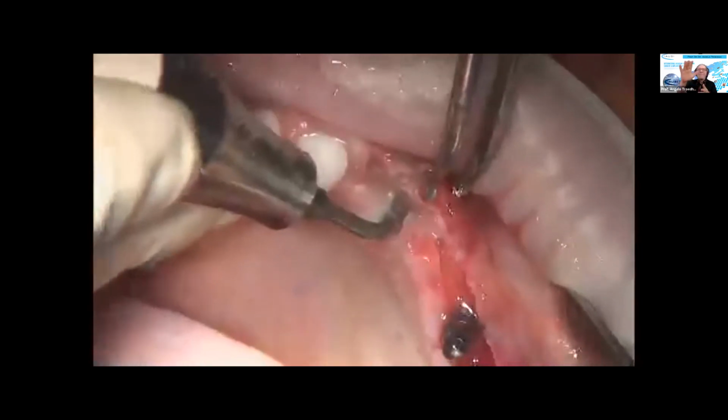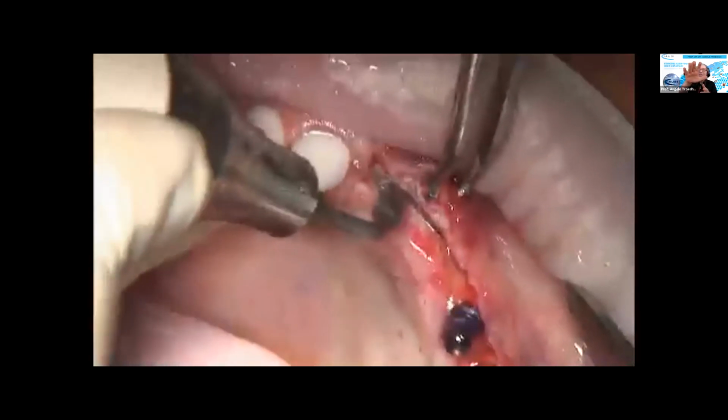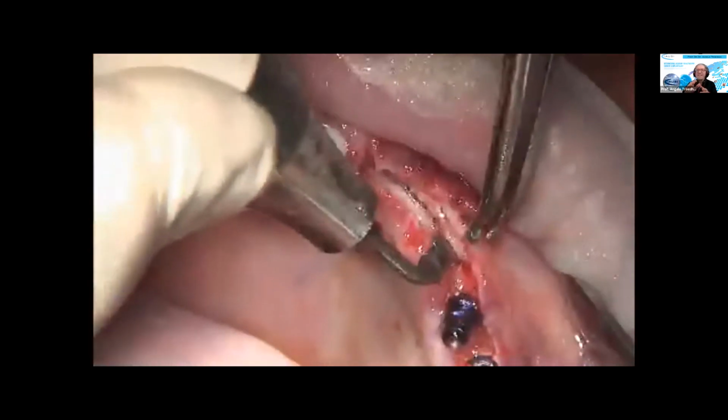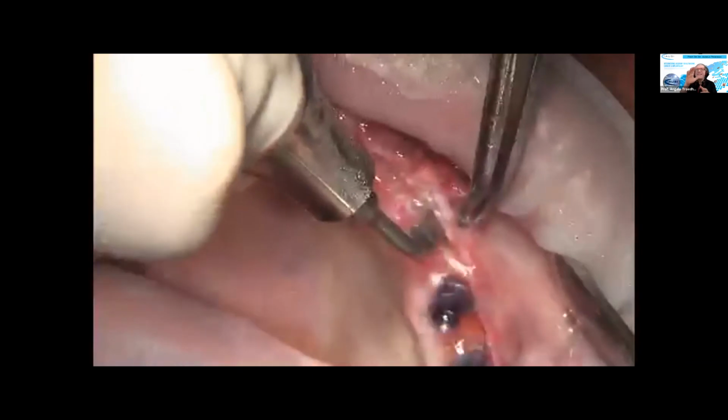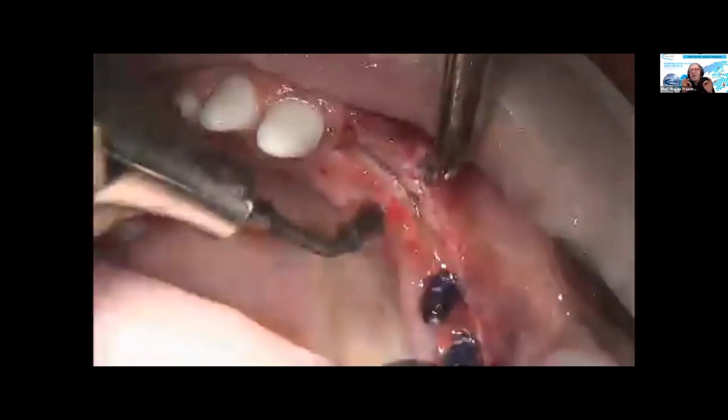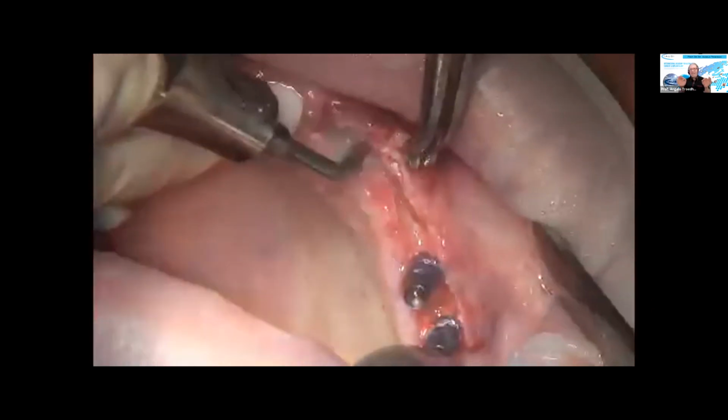Yeah. This with the CS tips number 4, 5, and 6, the risk of having accidental fractures during the distraction process is very, very low. It's about 1% again.